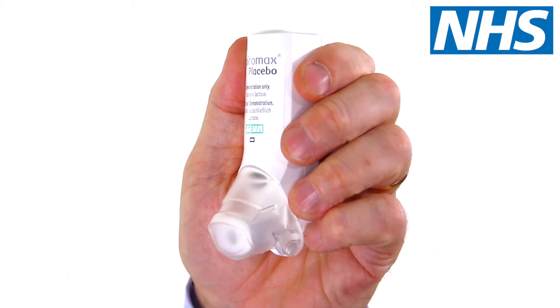You should always sit upright or stand up when using your inhaler. Hold the Spiromax upright with the mouthpiece facing down. Make sure that your fingers are not blocking the air vent. Open the mouthpiece cover by folding it down until you hear a loud click. Only open the inhaler when you're ready to use it.